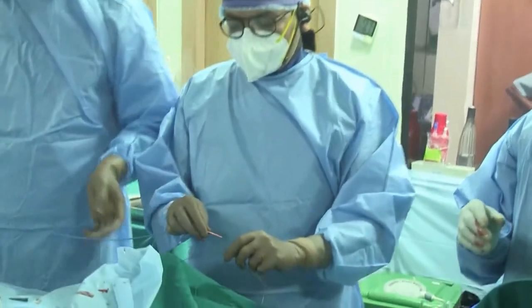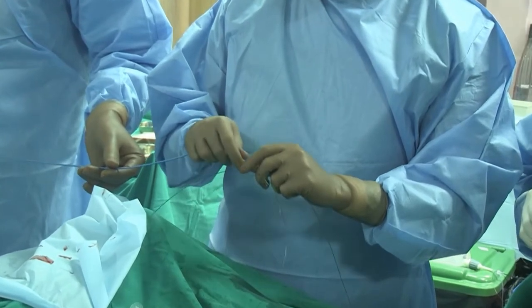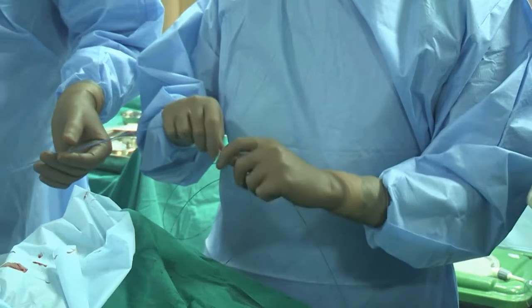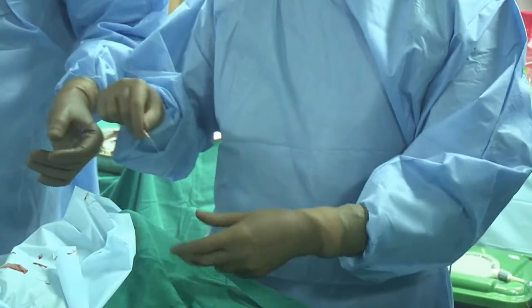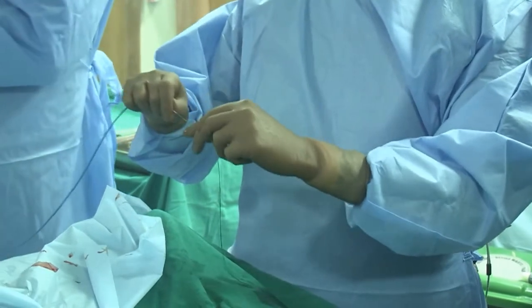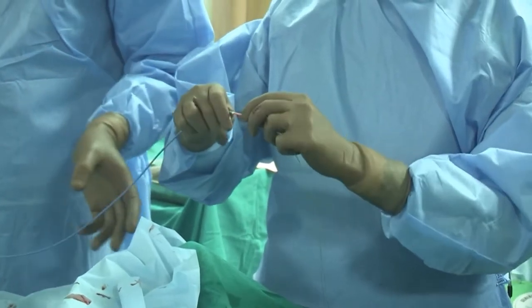There are two systems which are there now. This is for the ad hoc one where we already have the 5 French sheath. Otherwise, as you are rightly saying, we have this system, and it is very, very user friendly, very easy to use. Once we see this, I think it is quite easy. You can do it at the first go. There's nothing technically very difficult. So there is a rapid exchange port where we can do that.